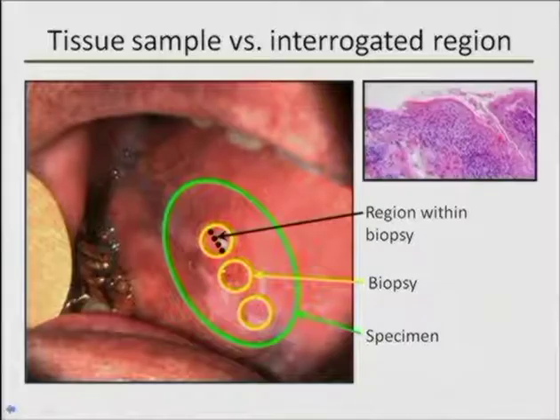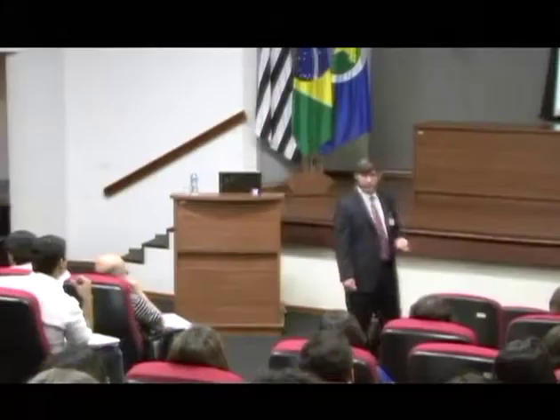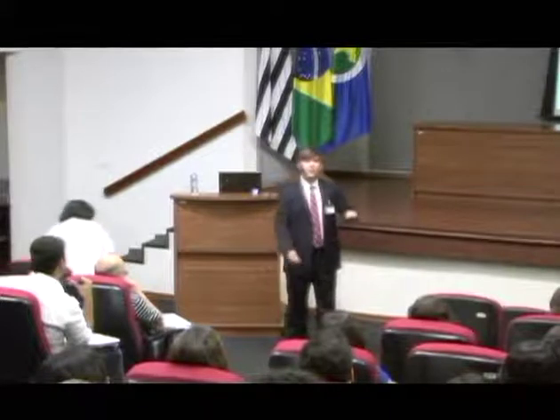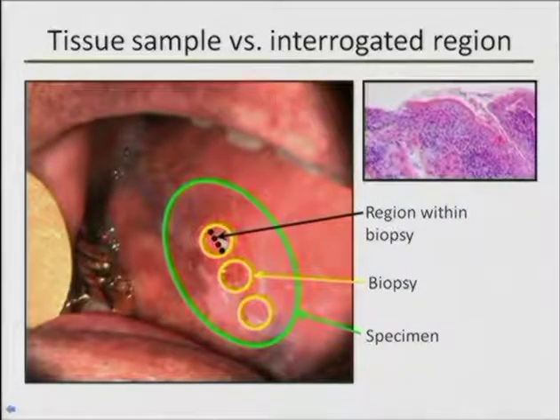And then let's say further that you looked at the individual regions within a biopsy, say going from anterior to posterior along the biopsy slide cross-section there. You may get several different histopathology diagnoses at each of those points. So you have to think very carefully about what makes sense to use as a gold standard, because if you haven't thought it through carefully, you're going to end up choosing whatever you feel makes sense given the various options that you have, and it can really impact what your diagnostic performance turns out to be.